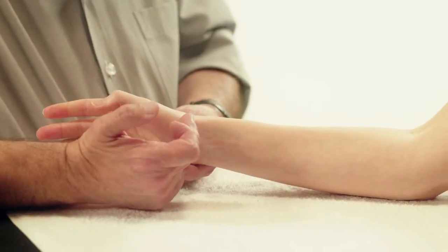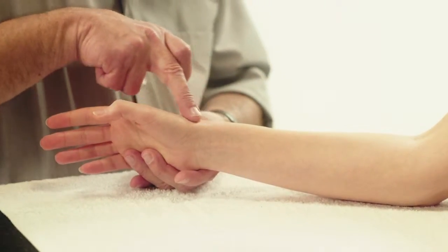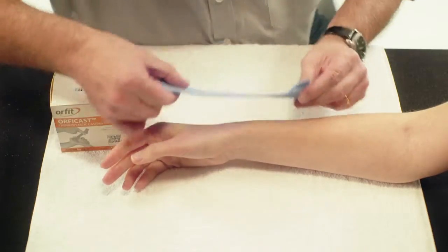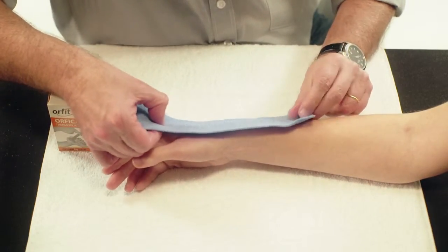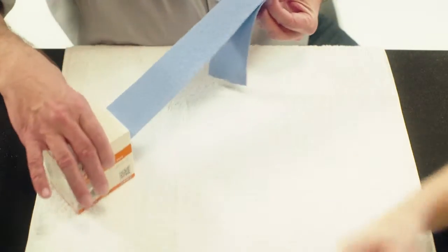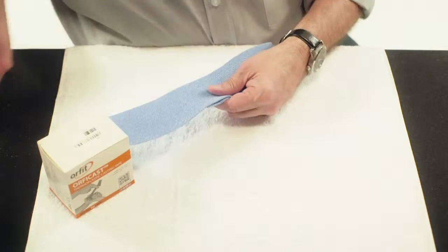A tendinitis of the extensor tendons of the first dorsal compartment. Cut two strips of Orficast 6 cm wide. Measure each two times the length from the thumb to the middle third of the forearm and cut the Orficast accordingly.